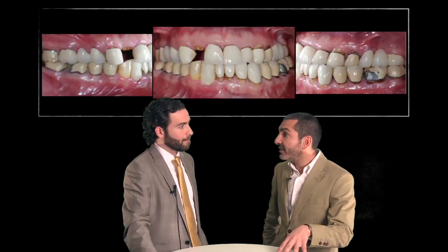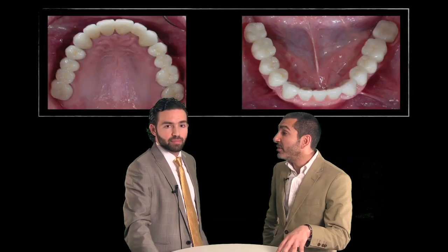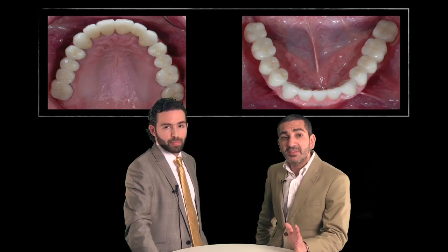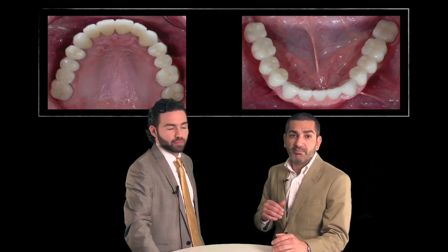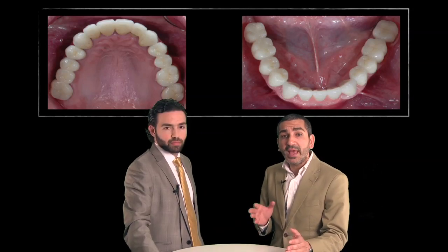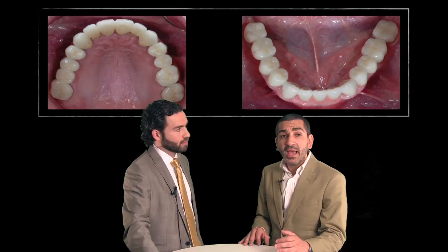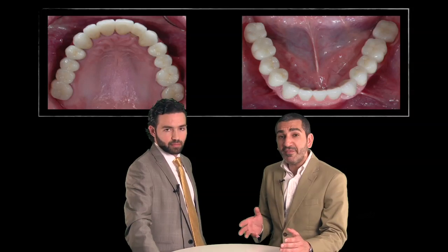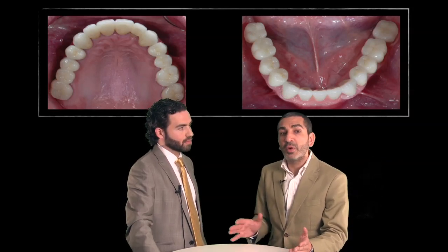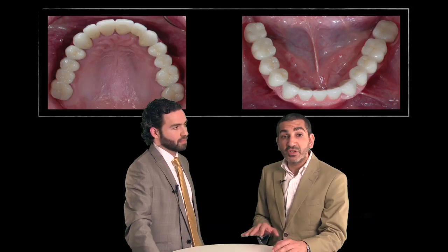I'm particularly interested in the occlusal view of the final restorations. And the reason I'm interested in that is that when you look at this, it is impossible for anyone to be able to tell if these are zirconia, lithium disilicate, or they are PFMs. Because with proper handling and manipulation, they just look nice, bright, beautiful, and we have the track record with the longevity and the easy delivery of these restorations. Really, for me, it's a no-brainer. Porcelain fused to metal crowns do have a place in dentistry today.